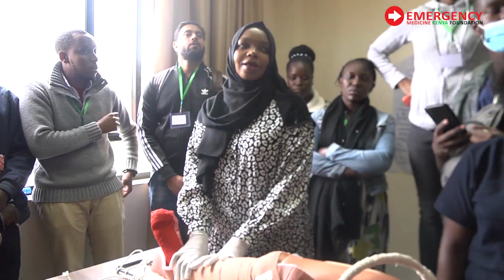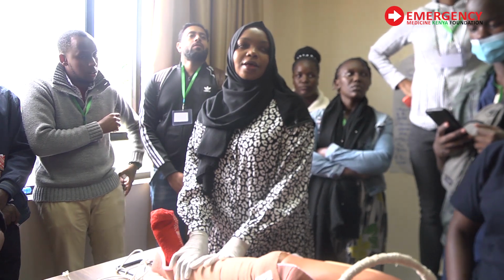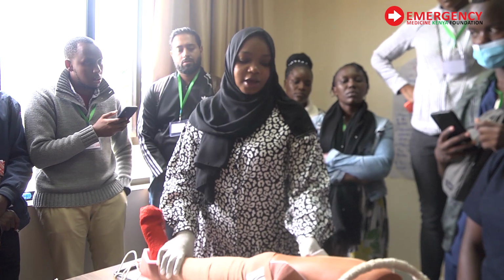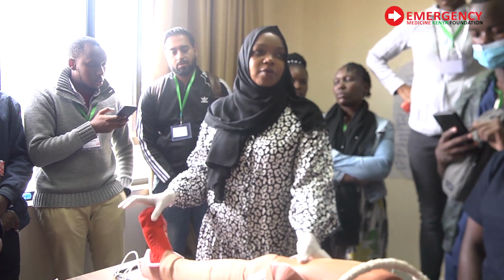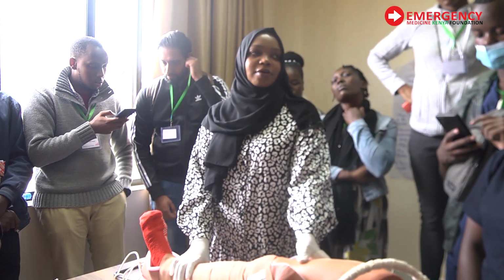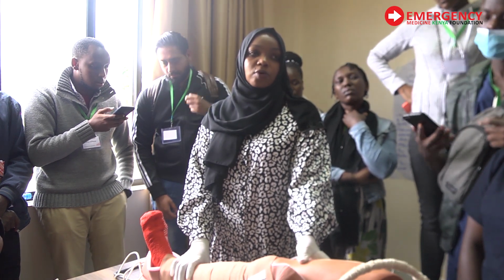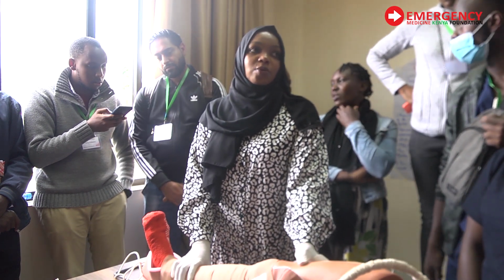We're supposed to secure now the limb to the Thomas splint with a crepe? No. It's stable like this because you have put your skin traction. You also want the patient to move. If you put the patient fixed like this, it's not a good thing.